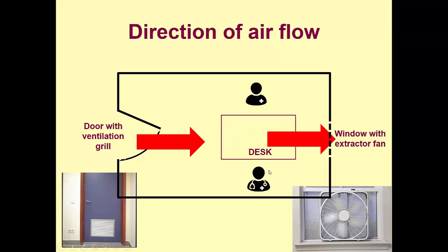You can now augment this by putting in a screen in between and say this person is going to do spirometry, and everything that is released during the spirometry procedure would be going out via the extractor fan without exposing the employee. So these are the type of things.